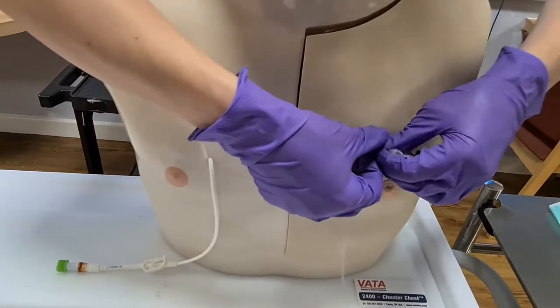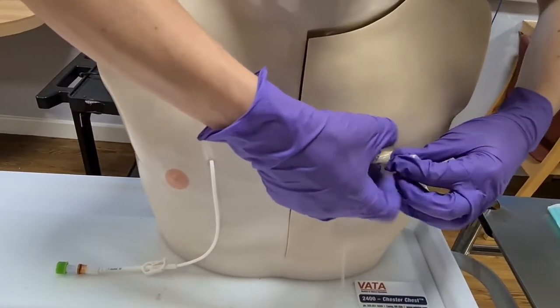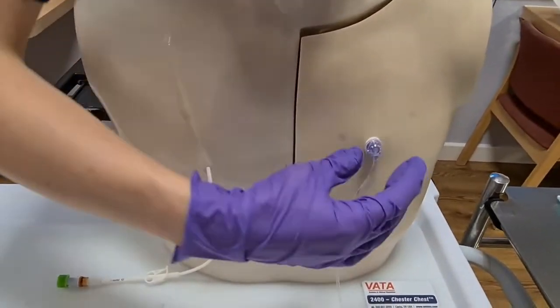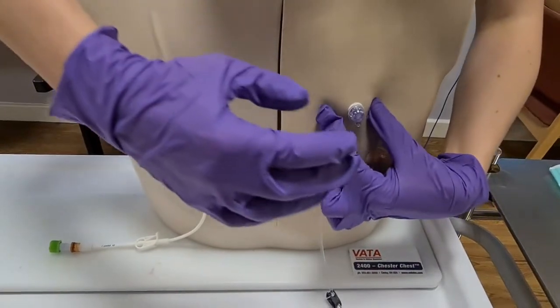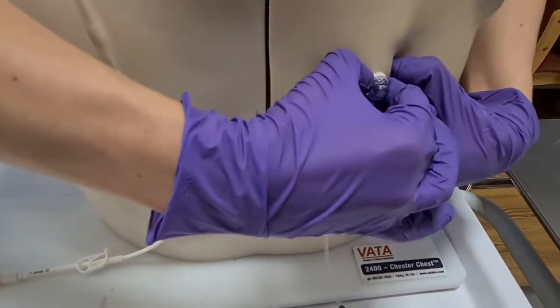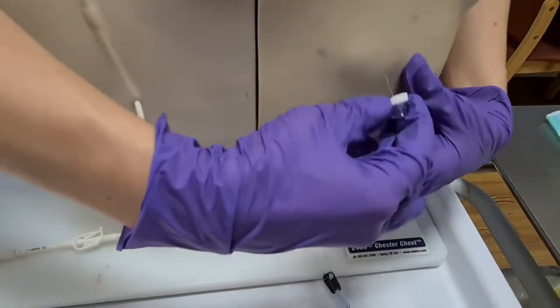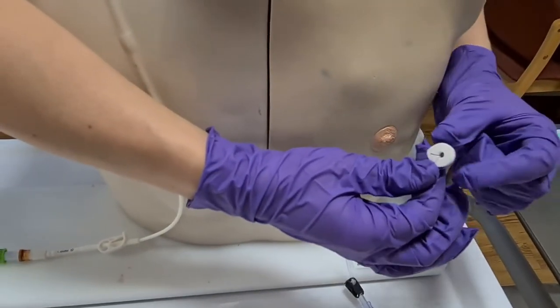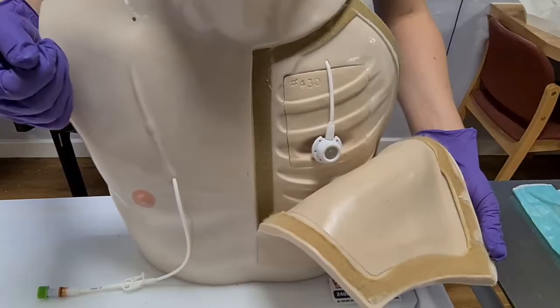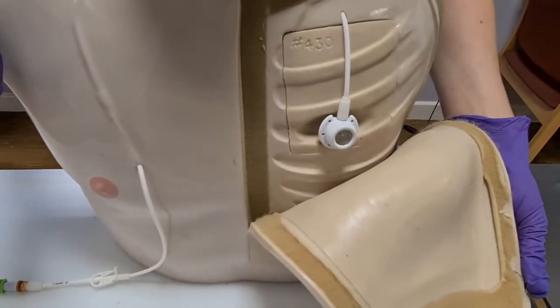Other areas might be using heparinized saline. So do ask the patient what is their normal regime. So make sure you hold on to the implanted port and take it out at a 90-degree angle. And that is what is left in your patient.